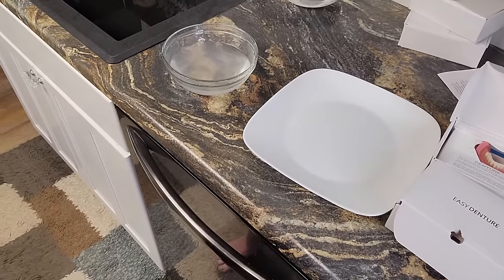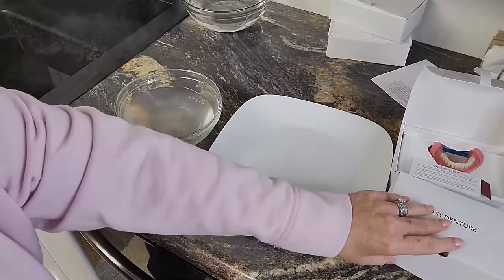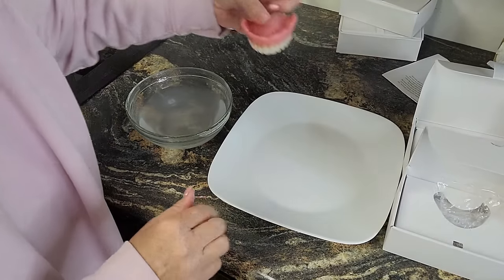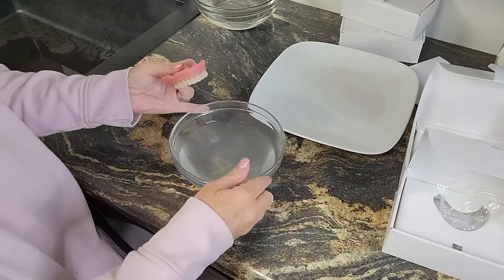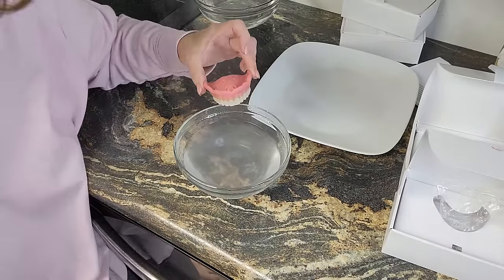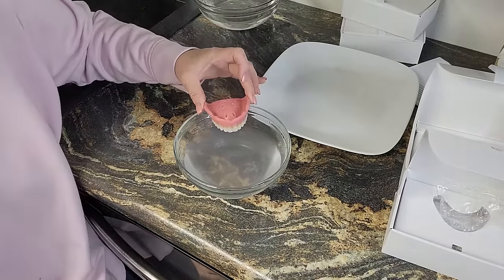They said to do this with the teeth down. So we're going to put this in the water with the teeth down — the picture shows the teeth up, but we're going to do teeth down.